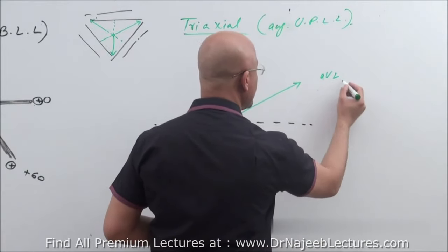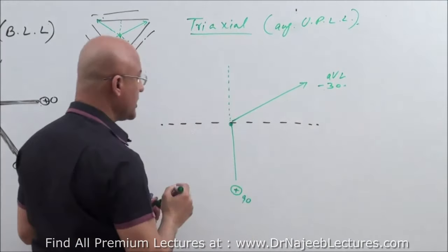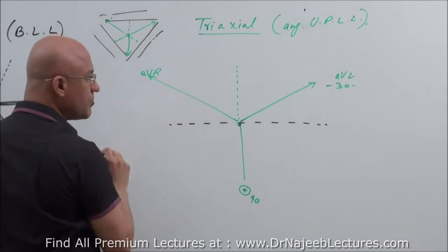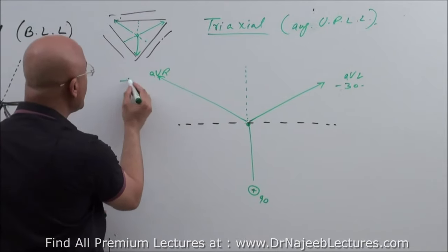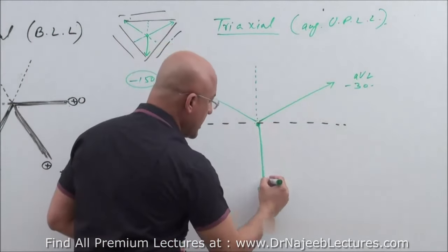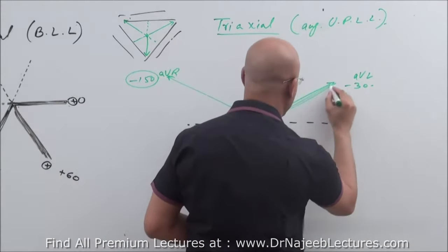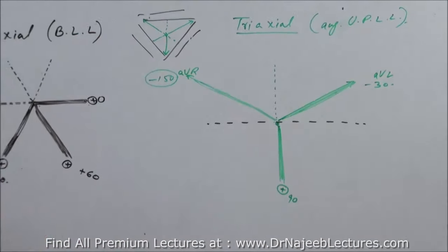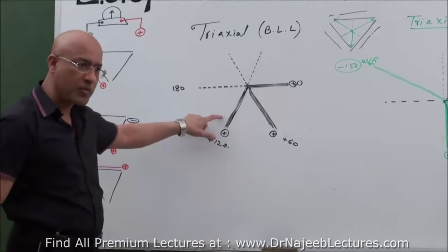AVL. And here was the positive, and there it is negative, minus 30 degree. And this is AVR. If it was 180, it will go minus 30, so it will become minus 150. So these are the orientations of the augmented unipolar leads in the frontal plane. Right? This diagram represents the triaxial diagram of orientation of bipolar limb leads.